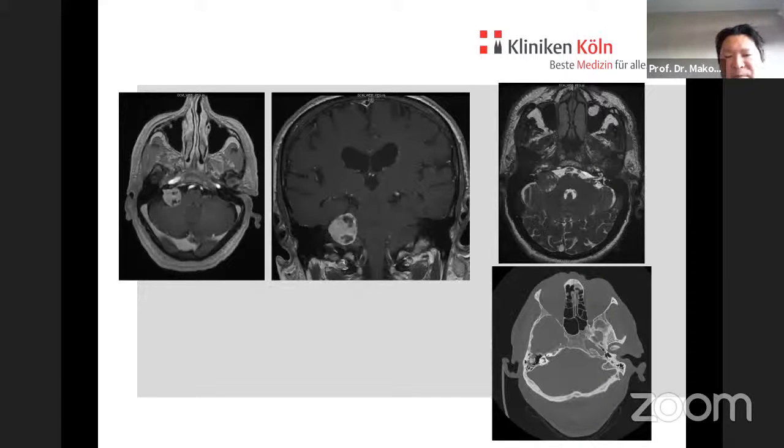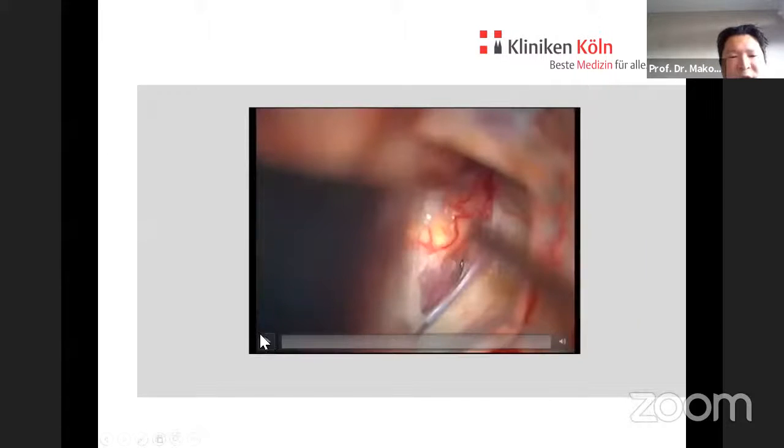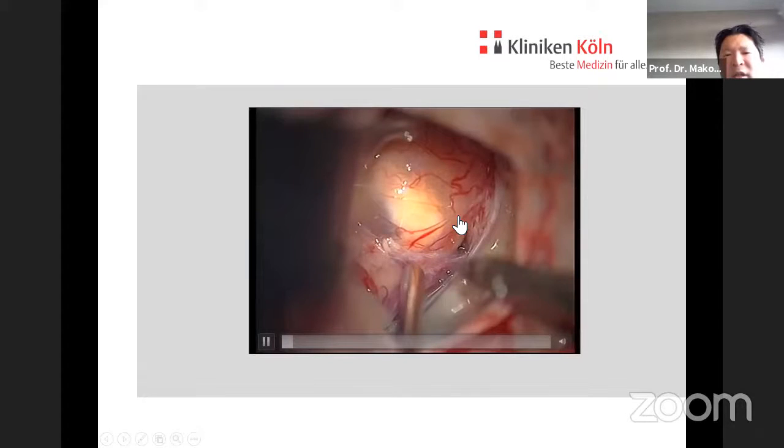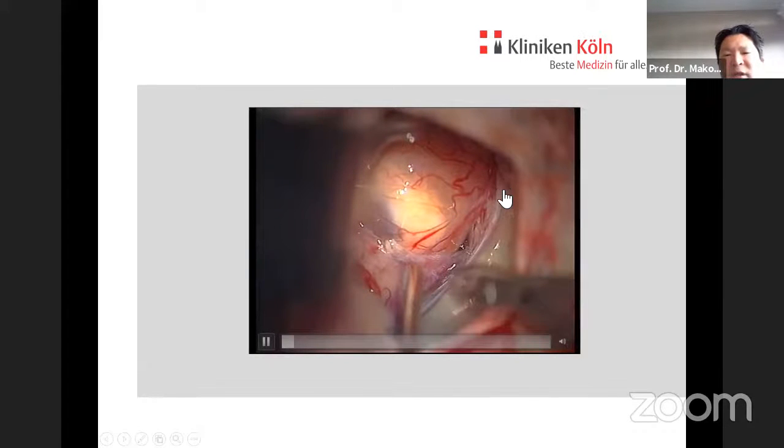The last example, a vestibular schwannoma on the right side, which is already a little compressing the brainstem. So also in a semi-sitting position on the right side. Now the cerebellum is retracted here. Now it's of course a very different situation. You don't see the petrous bone, you don't see the auditory canal.